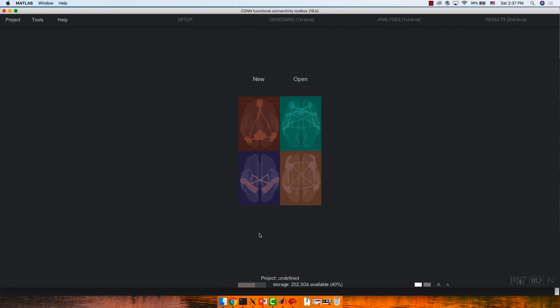You'll need to set a path that points towards the CONN directory in order for it to work. Here's the basic format. If you want to increase the font size, there's a big A and a small A at the bottom. Under Help > Documentation, the CONN manual is pretty good — virtually most questions can be answered right there.